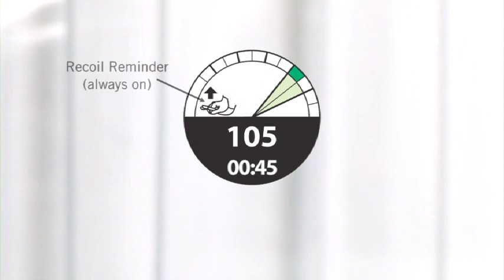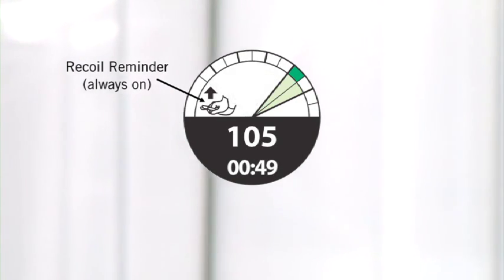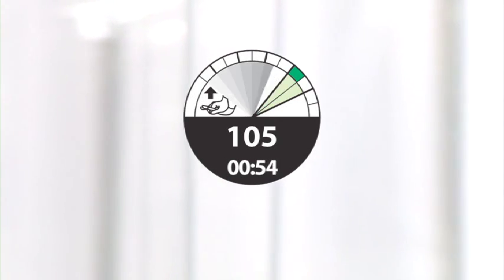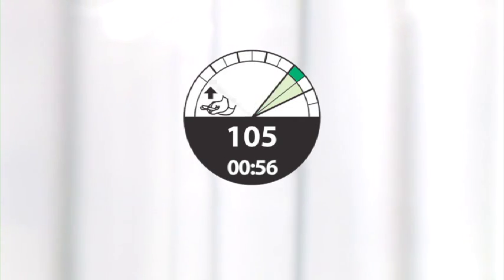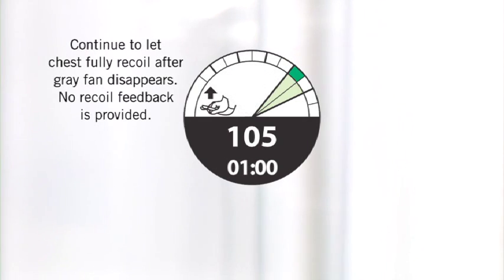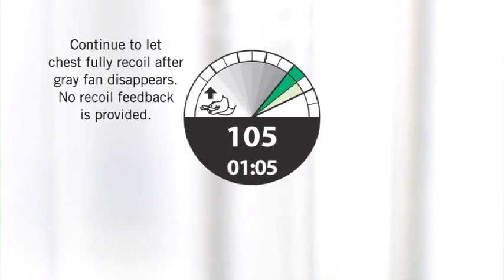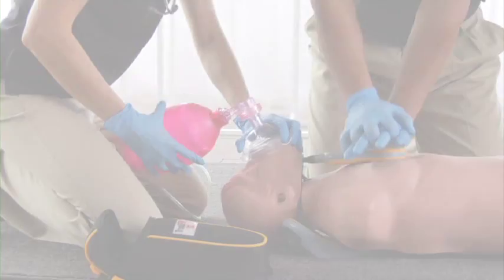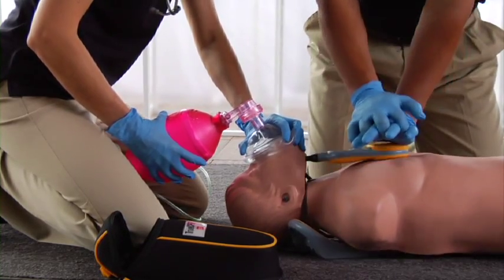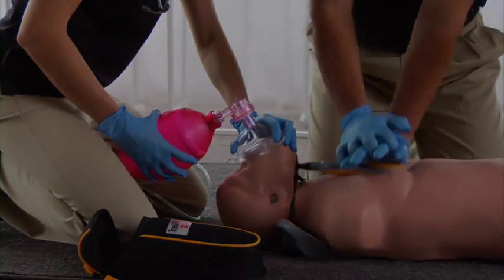On the other side of the dial is the recoil reminder. It's always present during CPR to remind you to achieve sufficient recoil during each chest compression. The gray fan will go away as you lift your hands up, but it doesn't mean you've achieved full recoil. Continue to let the chest fully rise after the gray fan disappears; the recoil reminder will help prompt you to do this. Follow the metronome to maintain your rhythm, hit your target zones, let the chest fully recoil, and watch your rate.